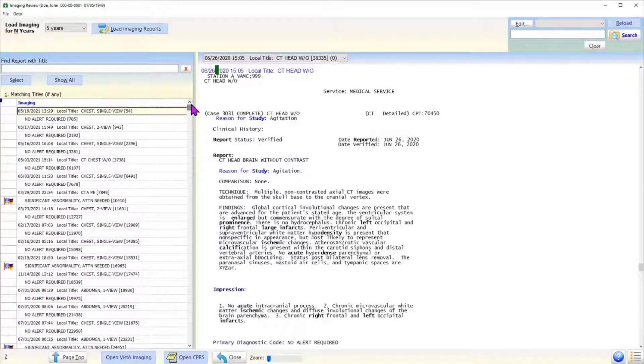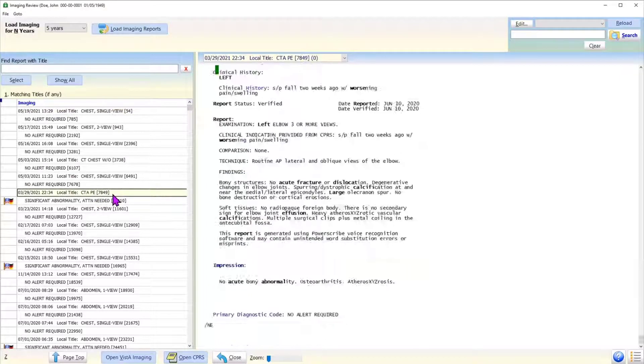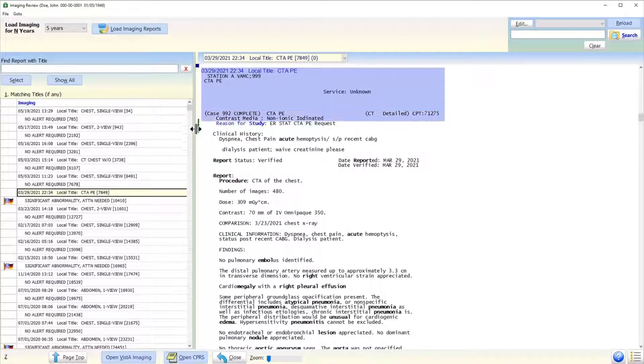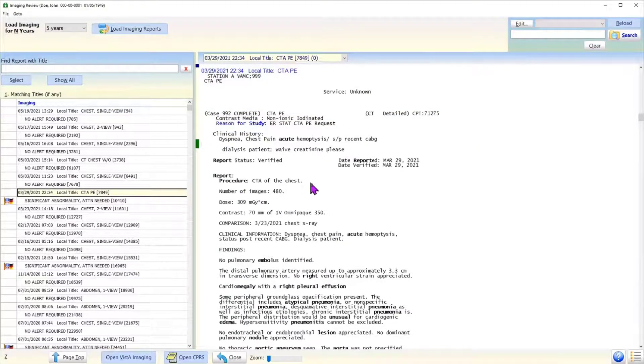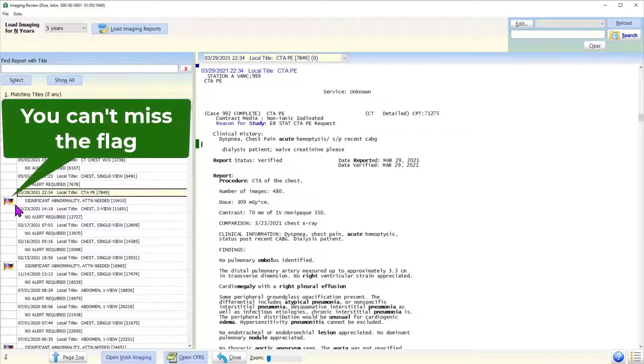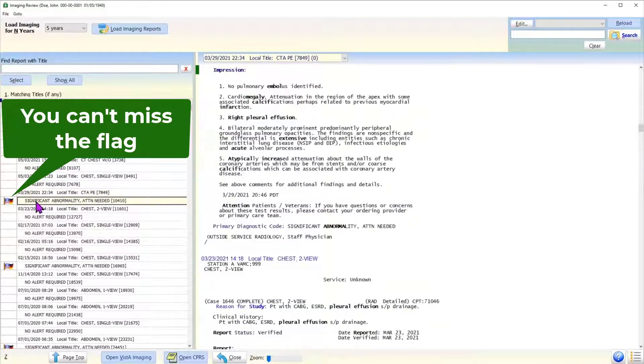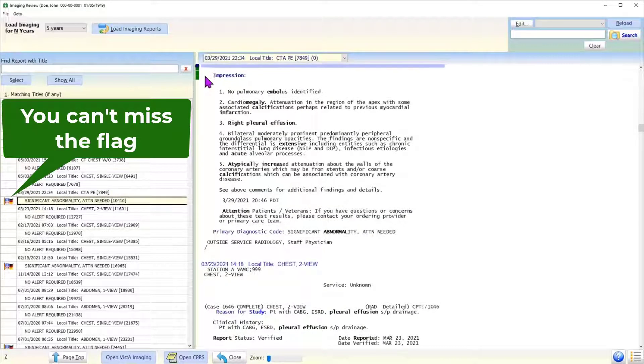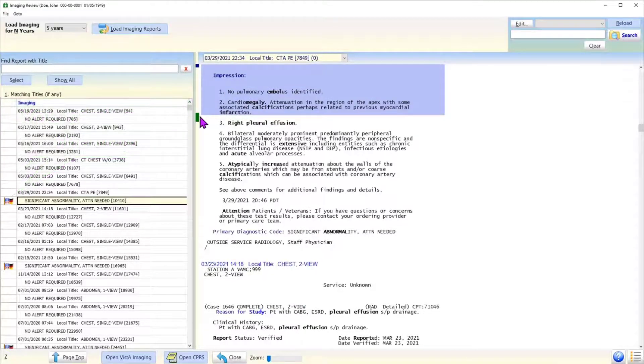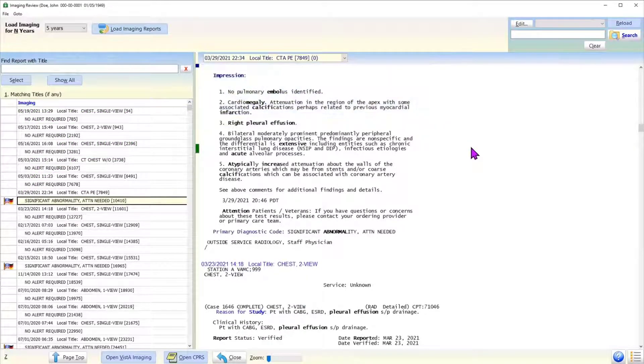Each report is shown on two lines. The first line shows report's date and title. A click on this line takes the user to top of that report. For the abnormal reports, the second line shows a flag. This ensures that the user will notice the abnormal reports. A click on the second line directly takes the user to the impression section of that report. This minimizes the need for scrolling up and down.